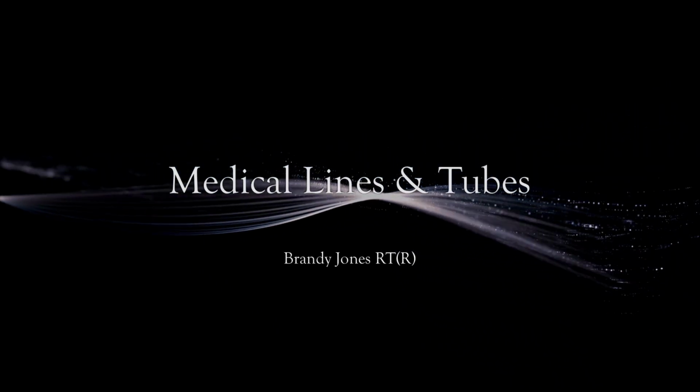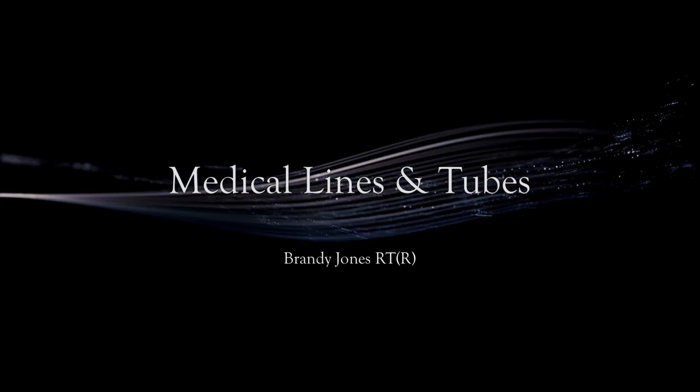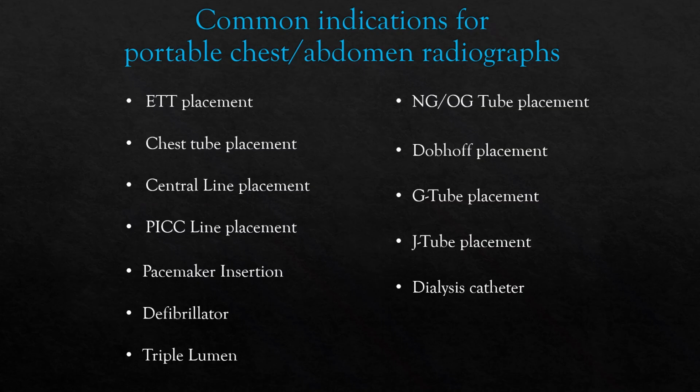Medical lines and tubes with Brandy Jones. Common indications for portable chest and abdomen radiographs: ET tube placement, chest tube placement, central line placement, PICC line placement, pacemaker insertion, defibrillator, triple lumen, NG tube, OG tube placements, Dobhoff placement, G tube placement, J tube placement, and dialysis catheter placements.